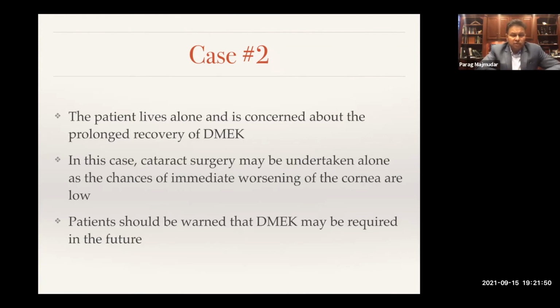I've done a lot of DMEKs. I've done a lot of cataract surgery over the years now, and I feel pretty comfortable that, unless there's some unforeseen situation, I can end up with a patient who has really low impact on their endothelial cells, especially when they're already starting off with very mild changes like 548 and a pretty good, healthy endothelial cell reserve, as you saw. And so I tell them that, look, you may need DMEK in the future. We'll keep monitoring this. If we get past the first few weeks or month and the cornea does well, then I think the cornea is not going to be an immediate concern.